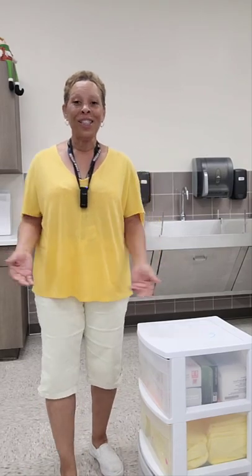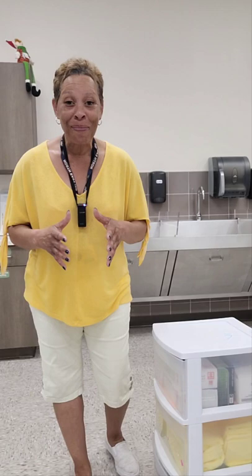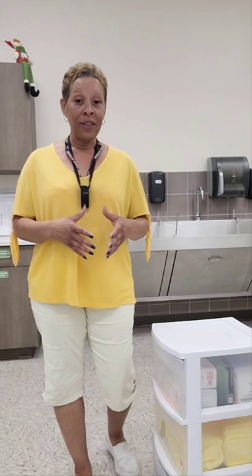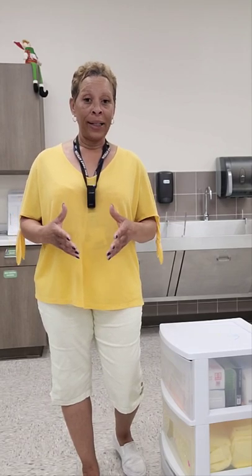Hey, what's up everyone? This is Julie Reynolds, aka Nurse Jar. In this training video, I'll be demonstrating the 2022 Headmaster Testable Skill: Donning and Removing PPE, Gown and Gloves Only, Emptying Urinary Drainage Bag, and Measuring and Recording Urinary Output with Hand Hygiene. You're actually performing four skills in one.